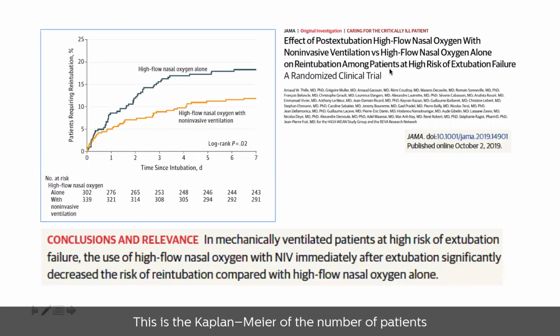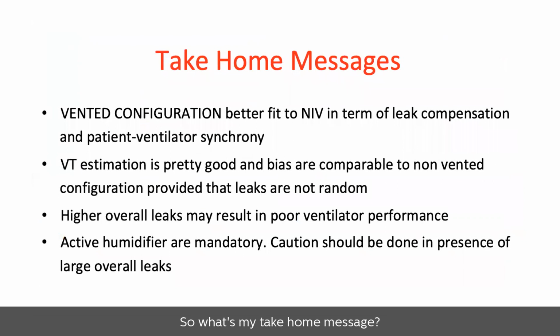This is the Kaplan-Meier curve of the number of patients who were reintubated at 7 days. And you can see the number of patients was much lower with the combination of high flow plus NIV. So what's my take-home message?